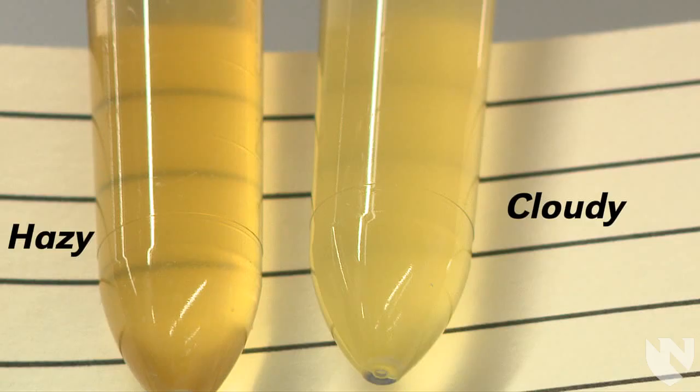Next, we have a hazy urine versus a cloudy urine. In the cloudy urine, we can hardly see the lines on the card and you can see some of those particles we mentioned.